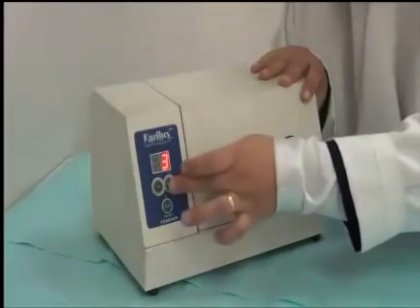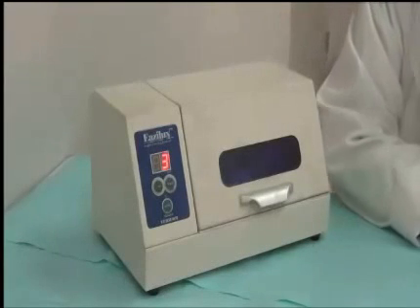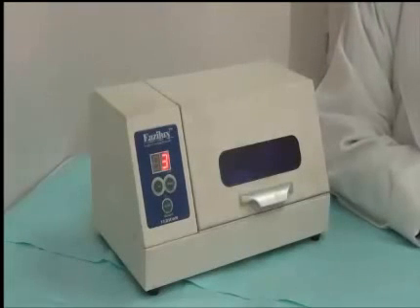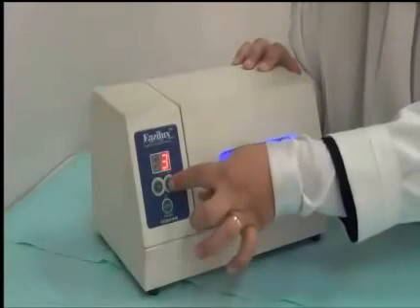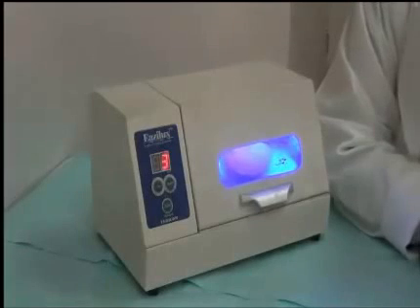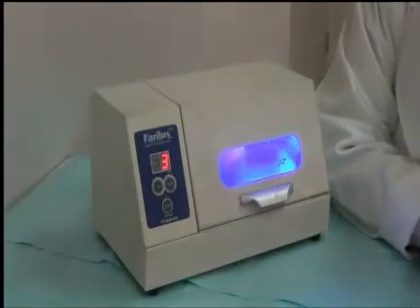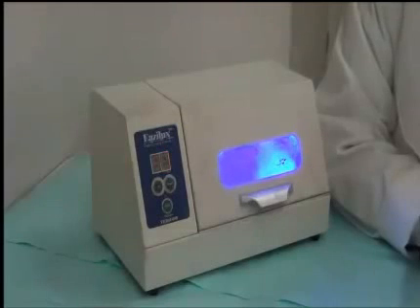The time is set for 3 minutes, and we will begin the light cure process. The light cure machine rotates while it's light curing.